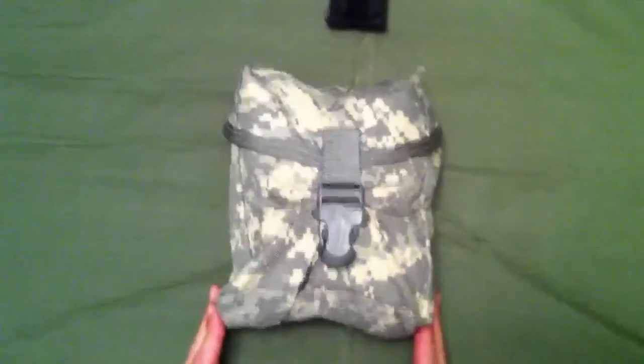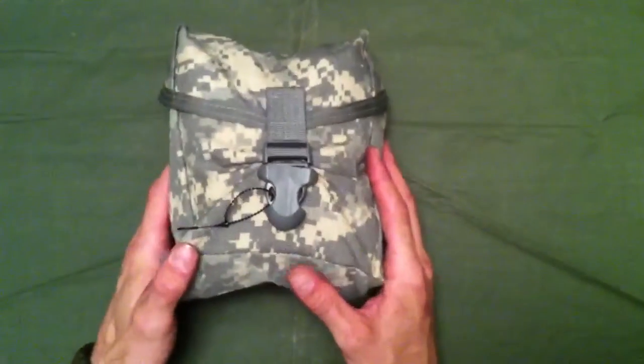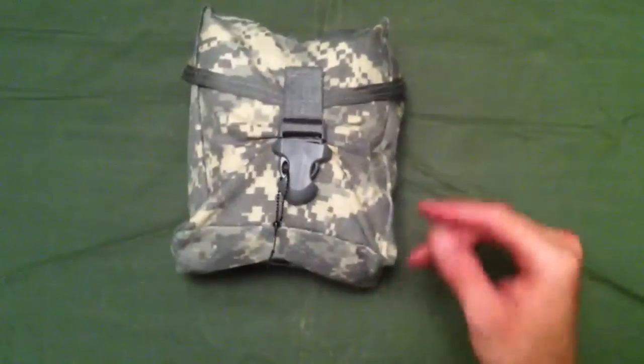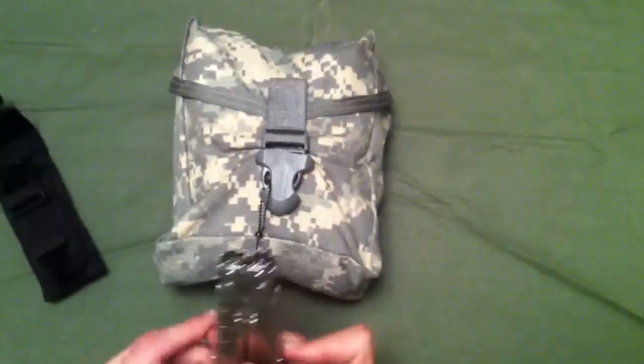What's up guys, it's Infidel Arms 556. Today we're going to take a look at an individual first aid kit ready for deployment. We got a few of them here and we thought it'd be kind of cool to open one up and show you guys what's in it.